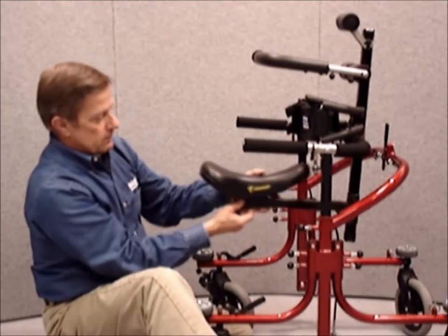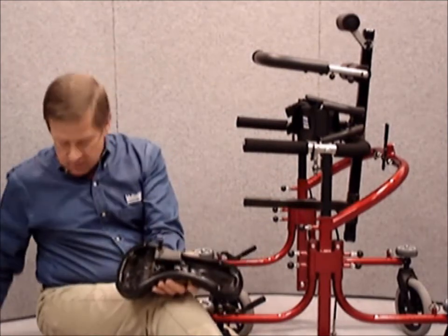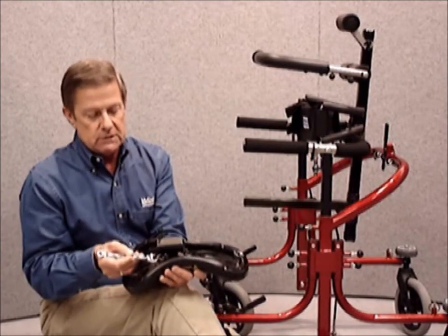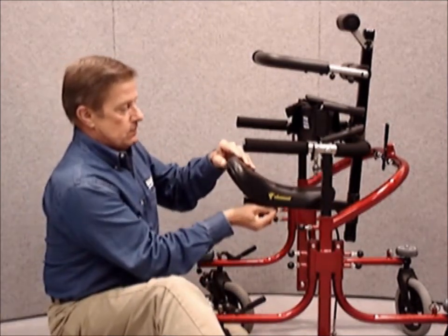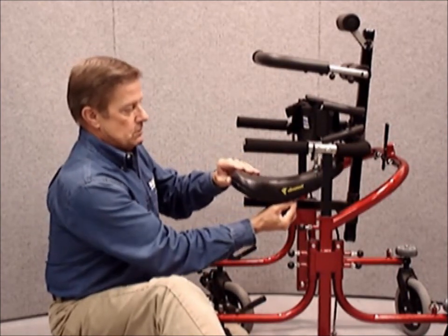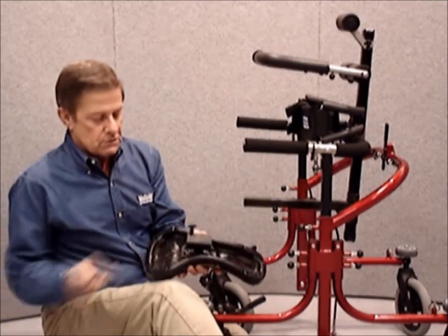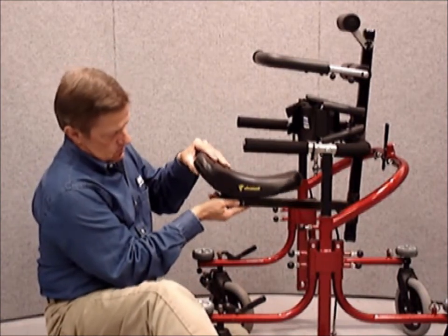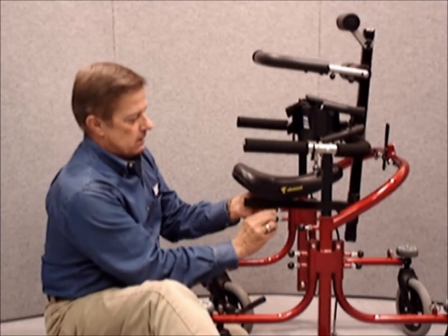Remove the unicycle seat from the unit. Underneath the seat there are 4 bolts or nuts that can be loosened. When these 4 are loosened, it will actually allow you to shift a few degrees in either direction on the seat. Once your desired position has been obtained, tighten again the 4 screws underneath. Flip the unicycle seat back onto the seat rail in the forward position or back and tighten down.